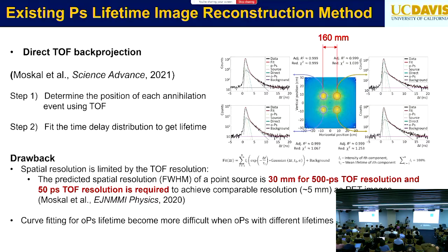Okay? So this really discourages people from developing this technique, because people feel 50 picoseconds timing resolution is still not available yet. But what I'm going to show you is we can actually get this resolution, better than 5 millimeter, even with the current time of flight system.